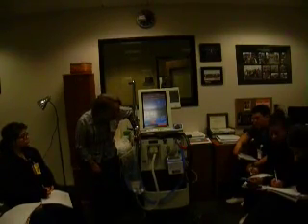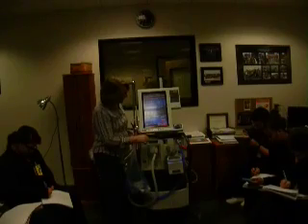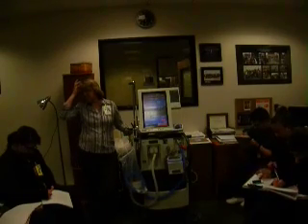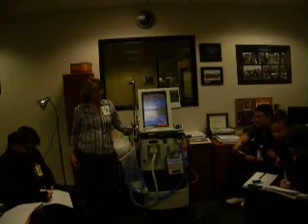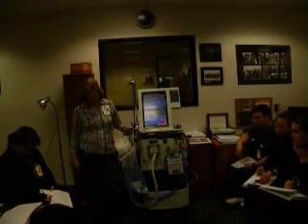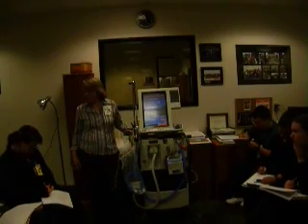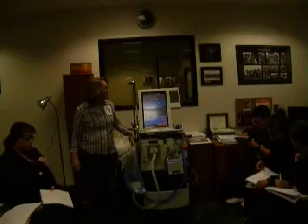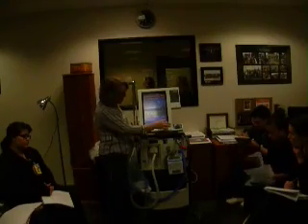All right. And then we have trigger type. V with a dot over it is always flow. So we have flow trigger or pressure trigger. Flow trigger is the preferred one that you will use. Your options are flow or pressure, but everybody uses flow, and I'll teach you more about why later. The pressure trigger says P-TRIG, T-R-I-G. In the flow trigger, it's V with a dot over it, and then the word trig. Okay, so we do that, and then you hit continue. So you set all of those where you want them to be and hit continue.